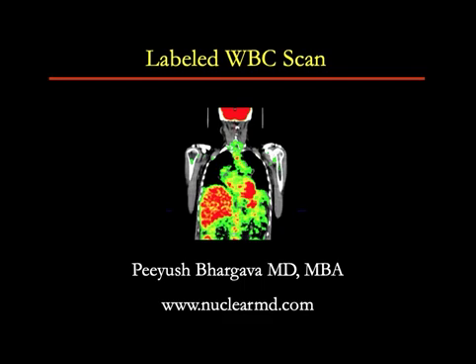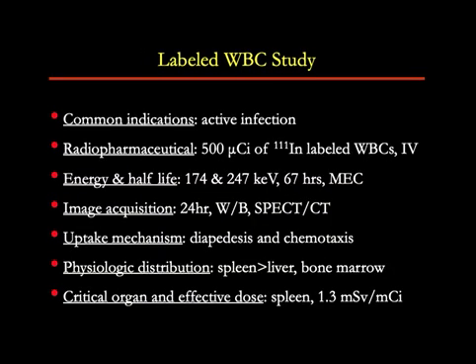Let's review the protocol. Labeled white blood cell scans are commonly performed to evaluate patients for active infection. The radiopharmaceutical used is 500 microcuries of indium labeled white blood cells. Indium-111 has two photopeaks, 174 and 247 keVs, and it has a physical half-life of 67 hours.